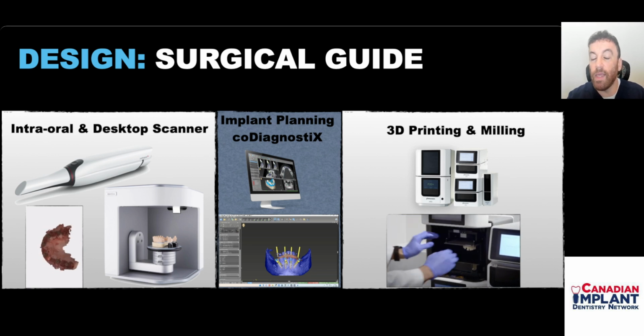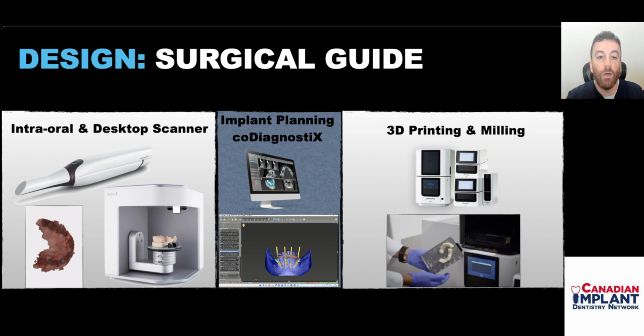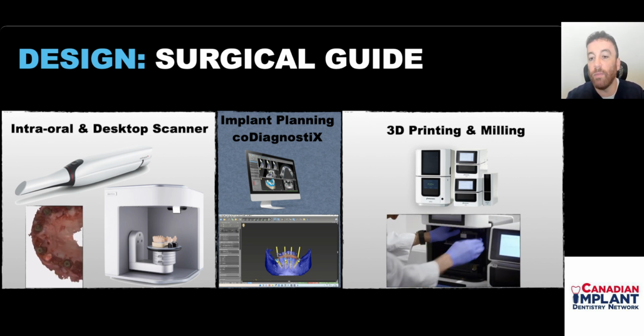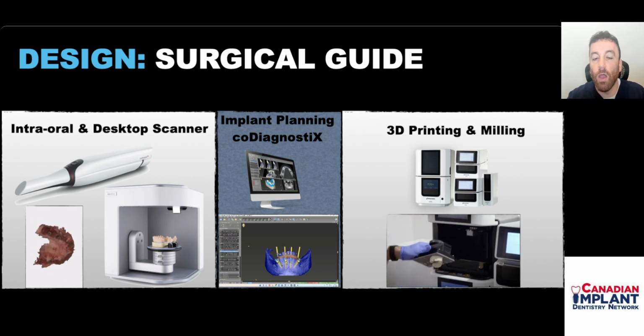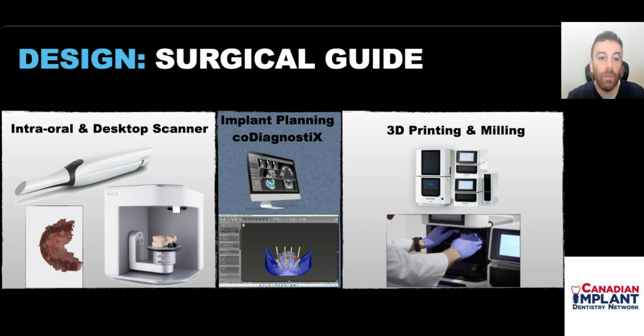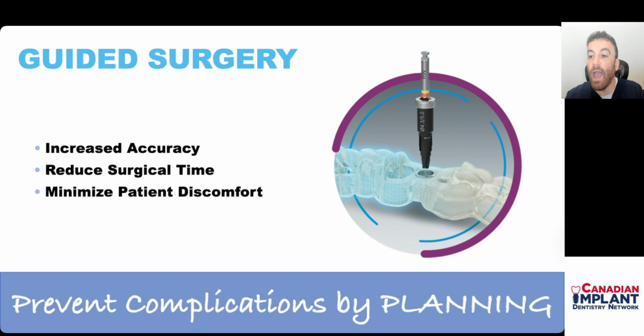Finally, we're able to 3D print. 3D printing has been a game changer in our practice. We're able to take that data, bring it into our 3D printer, and allow for same-day dentistry. So that has been a game changer in terms of what we can deliver with patients waiting in the chair and having temporization on the same day. And guided surgery, as we talked about, not only increases the accuracy of your cases, but also brings down surgical time and patient discomfort, with the end goal being preventing complications by planning of your cases.